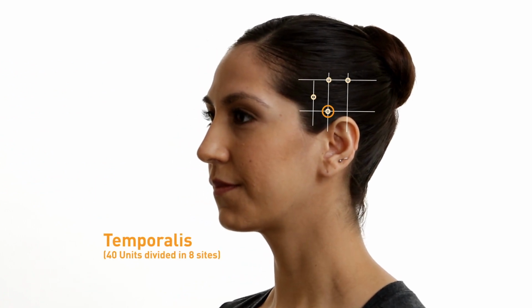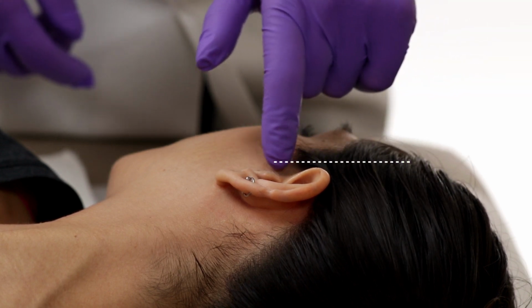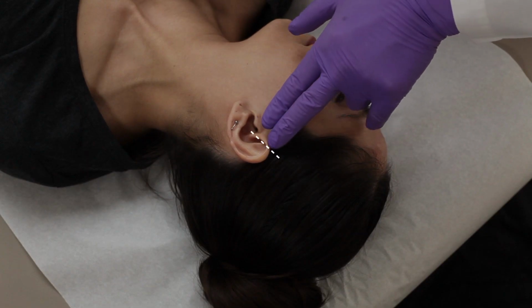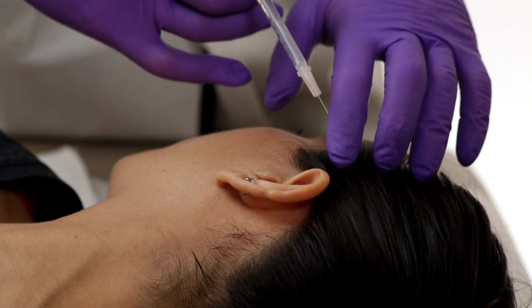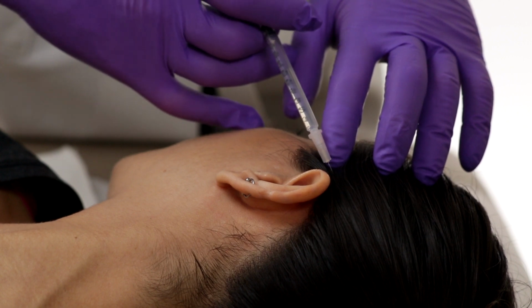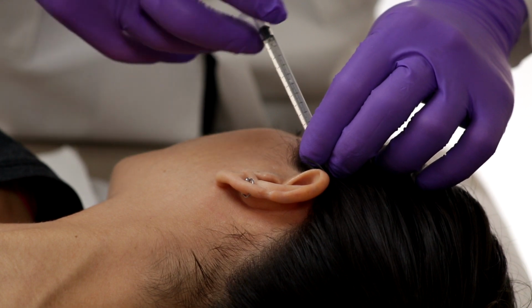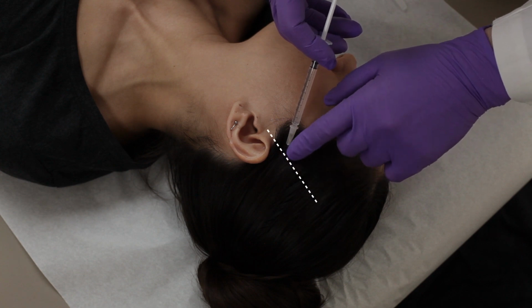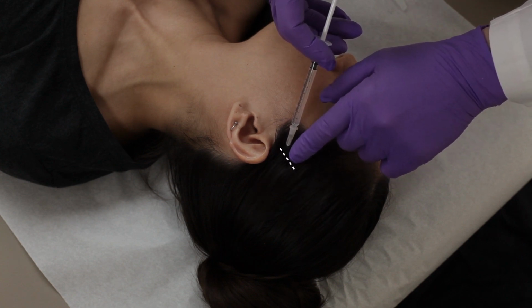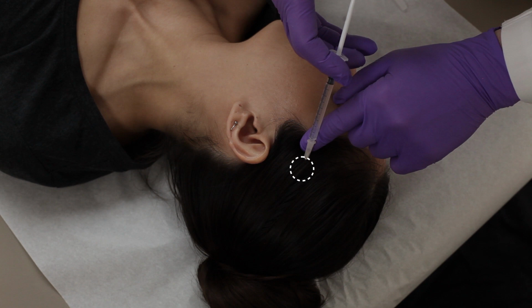To locate the first injection site, find the tragus of the ear and move your finger vertically up the side of the head approximately 3 centimeters or 2 fingers breadth. Keep the needle superficial and pointed at a 45-degree angle to avoid the periosteum. Stabilize the hub of the needle and inject Botox at the first site. This lines up with a vertical line through the tragus. Move approximately 1.5 to 3 centimeters or 1 to 2 fingers breadth up from the first injection, still in a vertical line with the tragus of the ear.